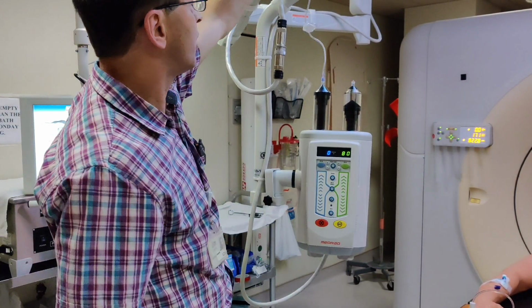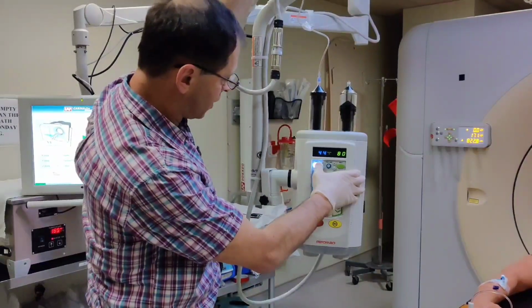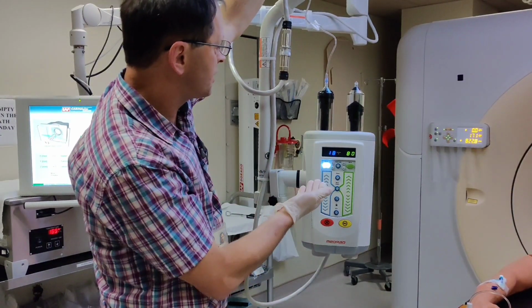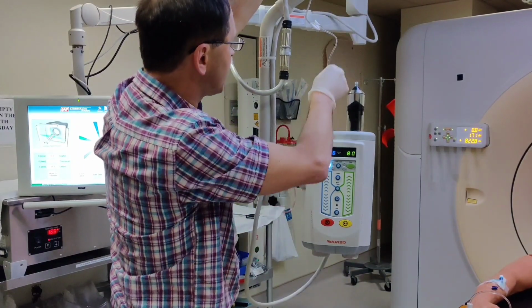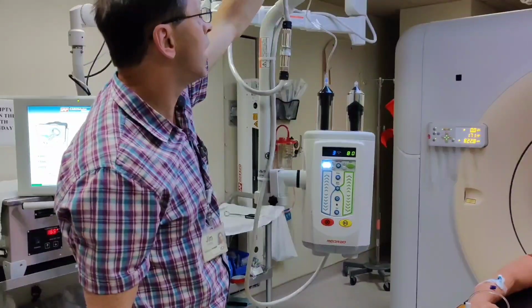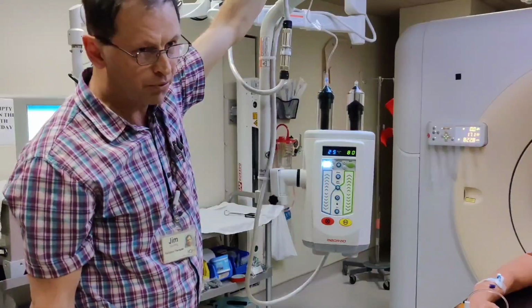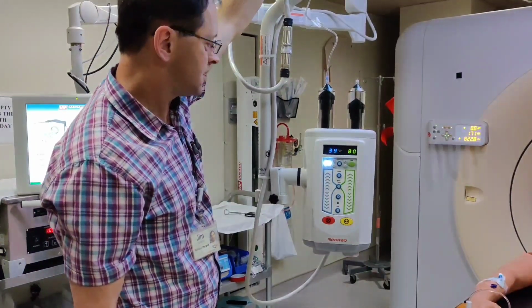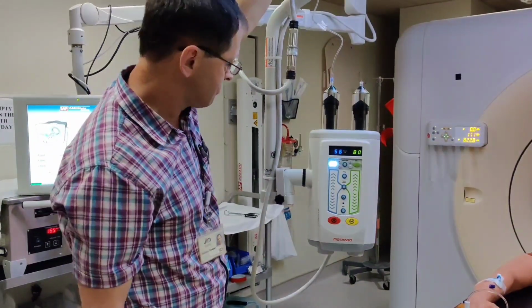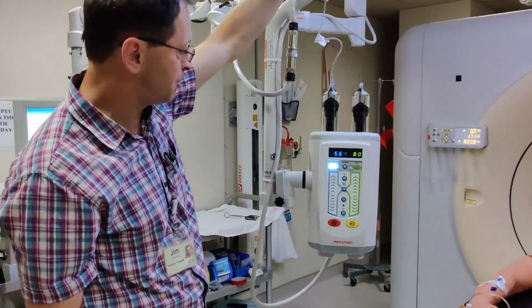Again, attach that. You'll again want gravity to work in your favor. I'm going to hit auto load and fill on the saline side, and the same process will be repeated. It's going to draw in the saline. Basically, it's getting rid of the air in the system, so it'll purge the air, and then it'll draw up the amount of saline required. Remember, this protocol, the bolus tracking protocol, required 40 cc's of saline. So again, we're going to want more than that to help prime the line. And you can be very aggressive here with the amount of saline you put in.